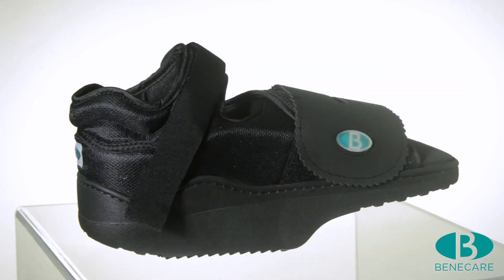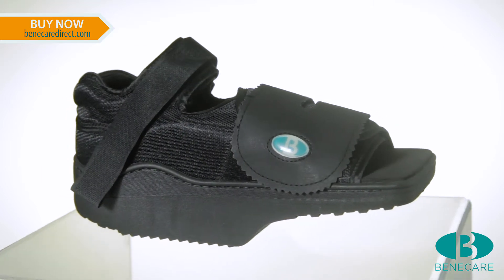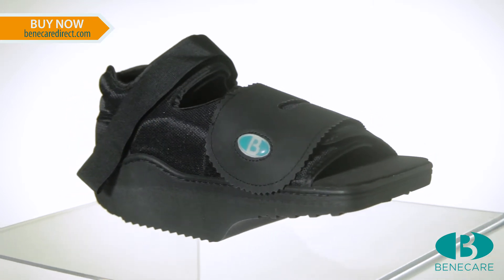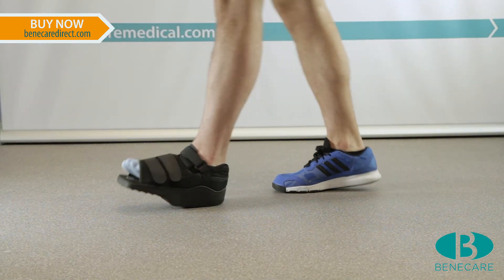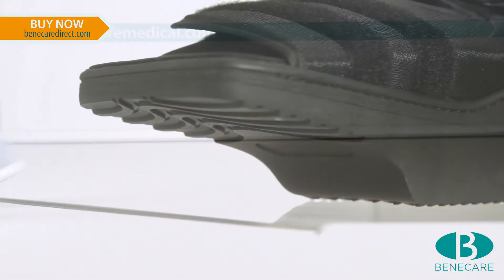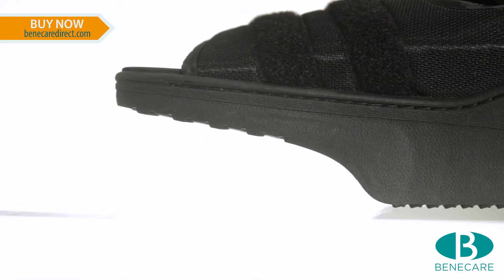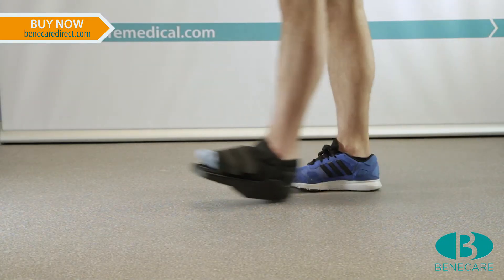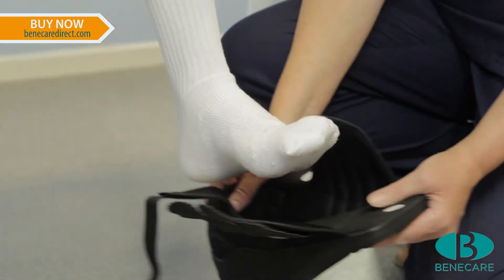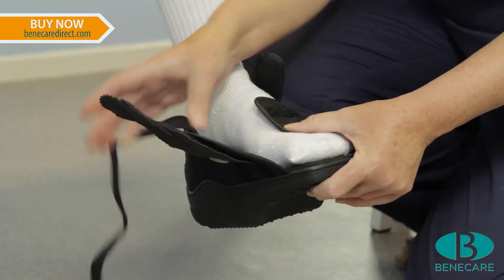Introducing the Benefit Wedge Shoe. It's a post-operative shoe that has been designed to provide pressure relief from the forefoot during weight bearing. The sole is angulated to provide 15 degrees dorsiflexion of the ankle, offloading pressure from the metatarsal heads, allowing the forefoot to heal. It is recommended for patients with diabetic foot ulcers and post-operative wounds.